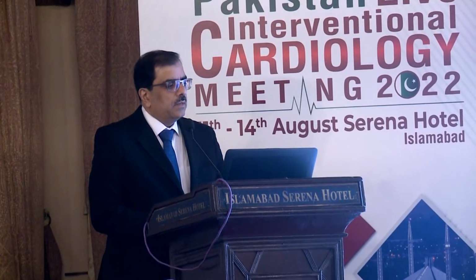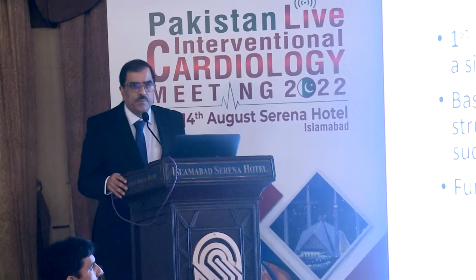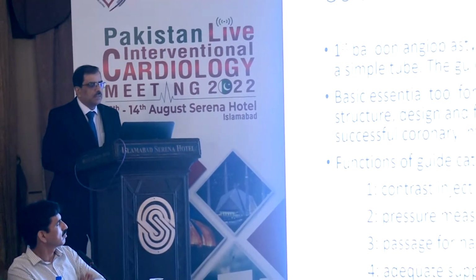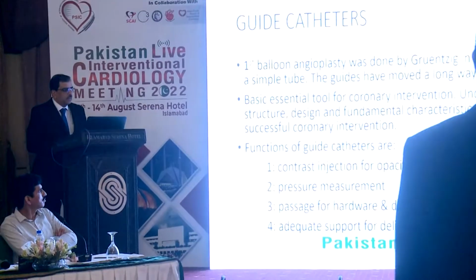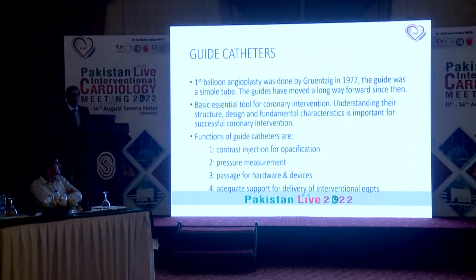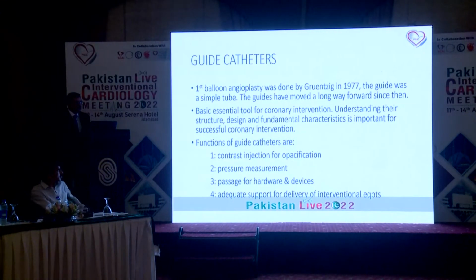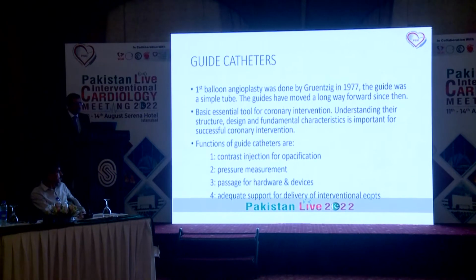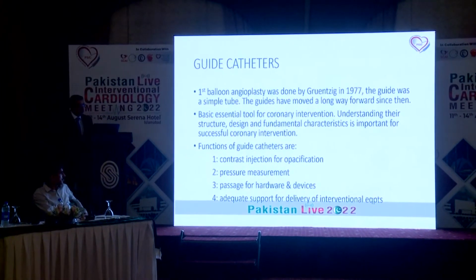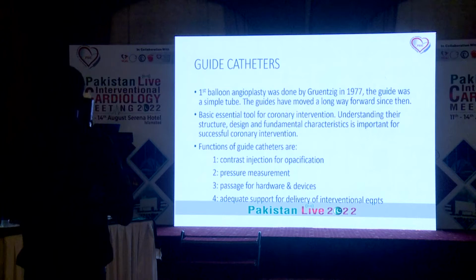The first balloon angioplasty was done by Gruentzig in 1977, and the guide was a simple tube at that time. So far, the guides have moved a long way. So it is very essential for us to understand the structure, design, and fundamental characteristics of these guides. The function of guiding catheters is, number one, contrast injection for opacification of the arteries, pressure measurement, passage of hardware and devices, and adequate support for delivery of intervention equipment.